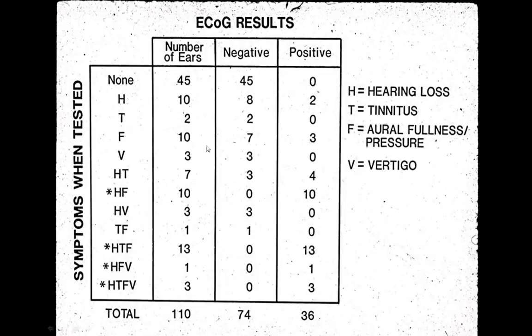We did other earlier studies that compared the results of an electrocochleogram to the symptoms the patients had at the time we did the test, because it became very apparent to me that I saw differences in the responses if a patient reported symptoms while we were doing the test versus those who came in and said, well, I had the symptoms a few weeks ago, I saw my doctor, you scheduled me to do this 2 weeks ago, but I don't really have any symptoms at all today. And remember that hydrops in Meniere's is an episodic disorder.